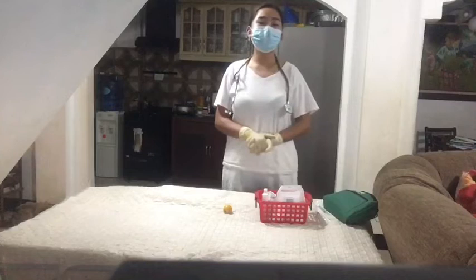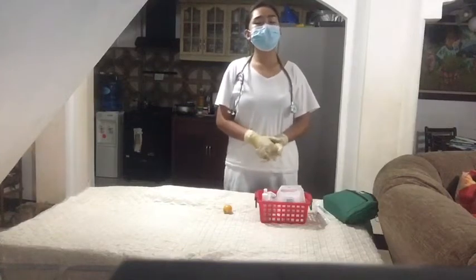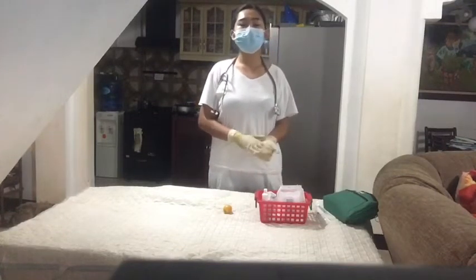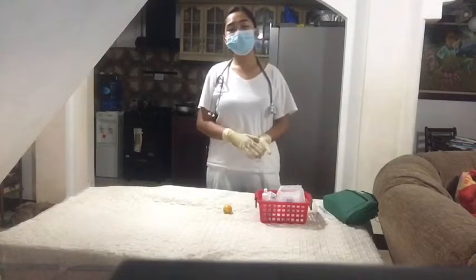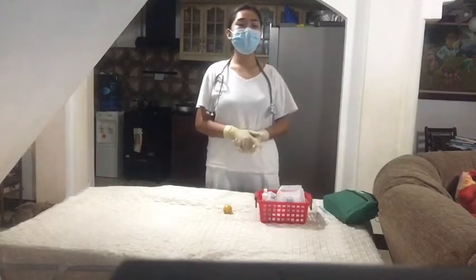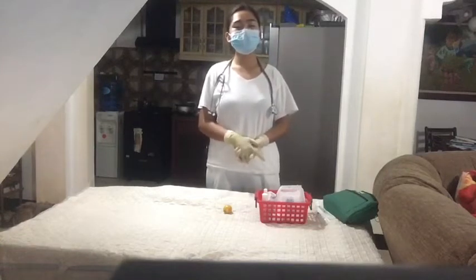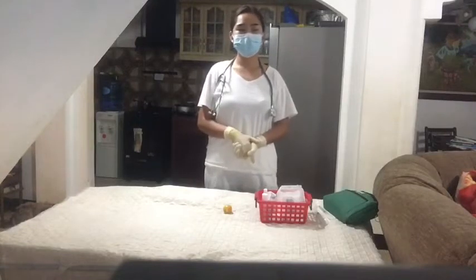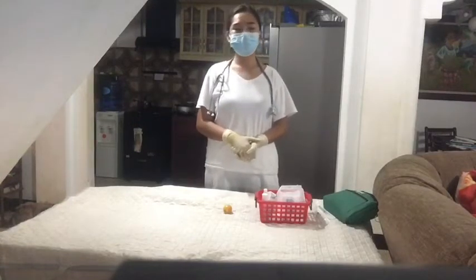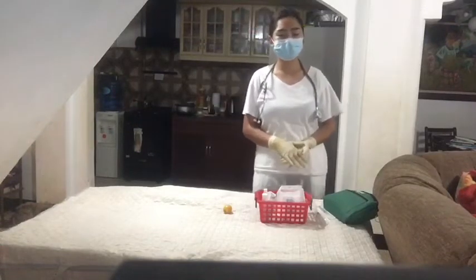In this video, I will be administering the intramuscular injection. So the first step is to perform hand hygiene and observe the appropriate infection control procedures. This is to reduce the number of microorganisms on the hand. So since I am done washing my hands, I will now proceed to the next step.